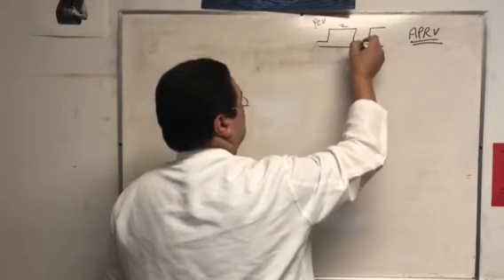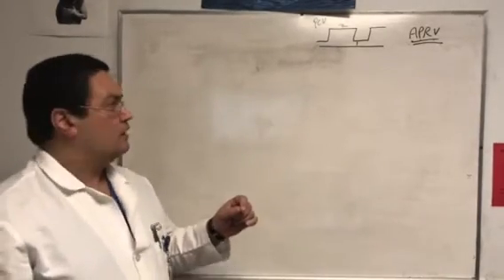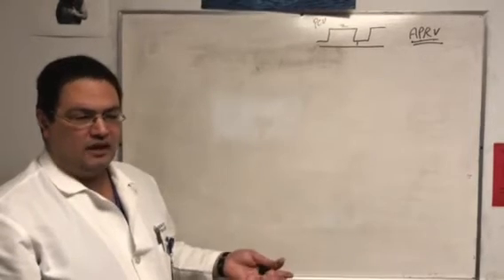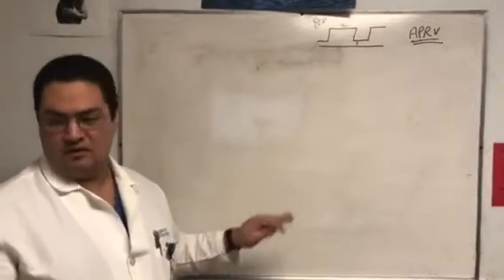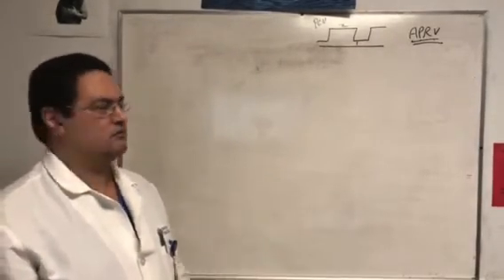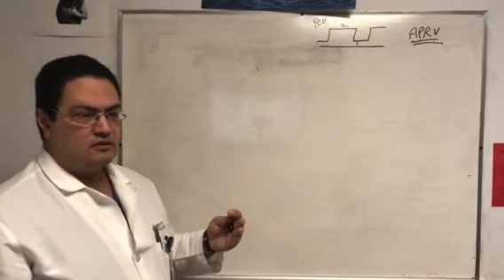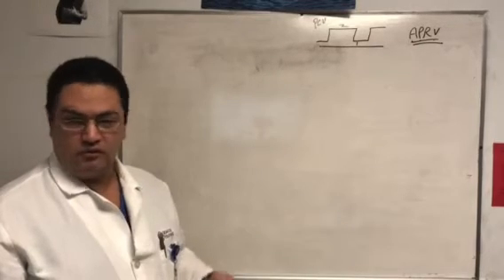That's what pressure control waveform looks like. And an inverse ratio. So when somebody has a severe hypoxia, we put them in an inverse ratio and paralyze them. And when we paralyze them, we're limited. We can't paralyze them for more than 1 day, 2 days at the most. If you paralyze more than 2 days, then they'll be very weak and they need a trach. So the dilemma starts when somebody still needs the paralysis, still very hypoxic at the end of 2 days. What are we going to do?